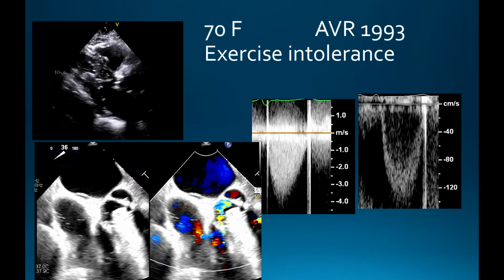So this is a case I think highlights mostly what we do. It's not as spectacular as the first case of Dr. Zoghbi. I think this is Dr. Faza's patient. It just happened, I think, 2 weeks ago.